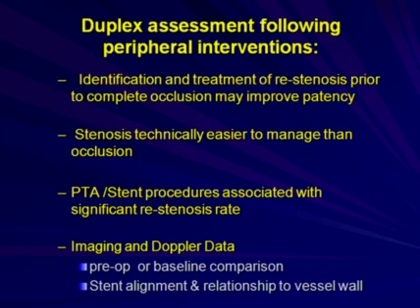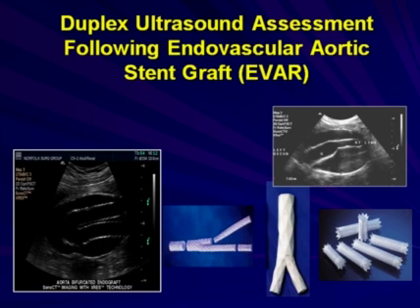We're going to use our imaging and Doppler data. We're going to look at the pre-op or baseline comparison and really pay close attention to the stent alignment and relationship to the vessel walls.